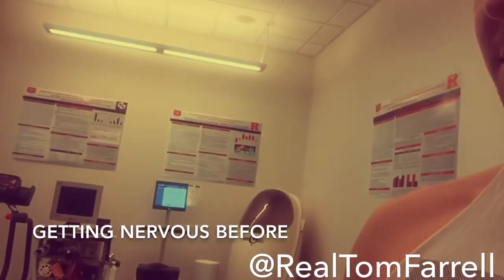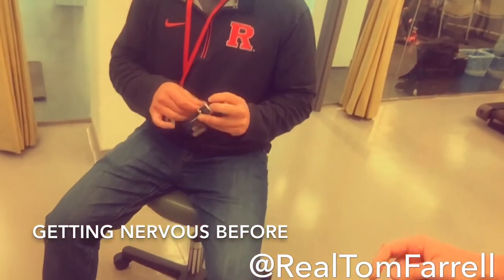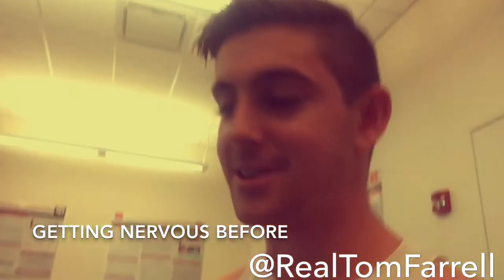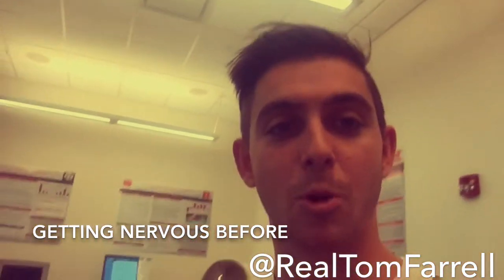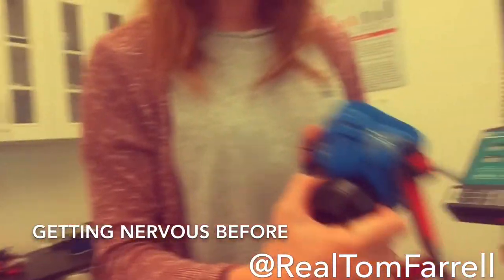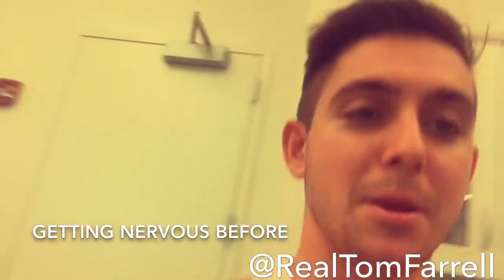Can I wear the watch? Yeah, I can wear the watch. I'm not showing faces. That's a good thing — I can see at what rate I'm dying. And check out this little mask. Gonna be looking like Bane in here.